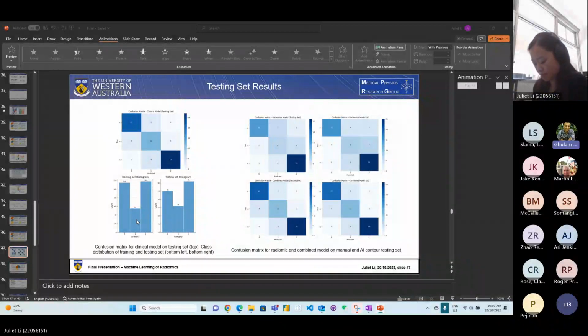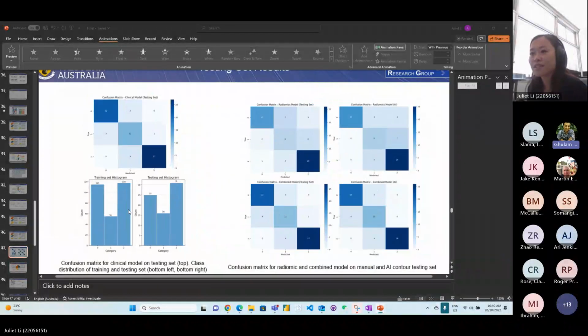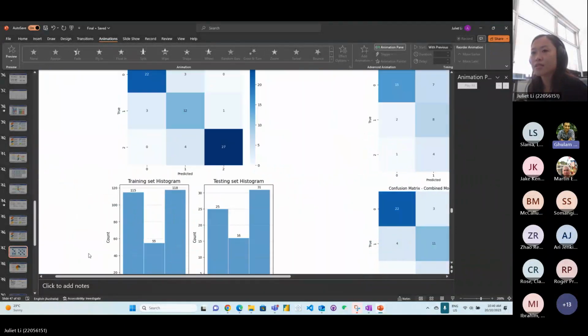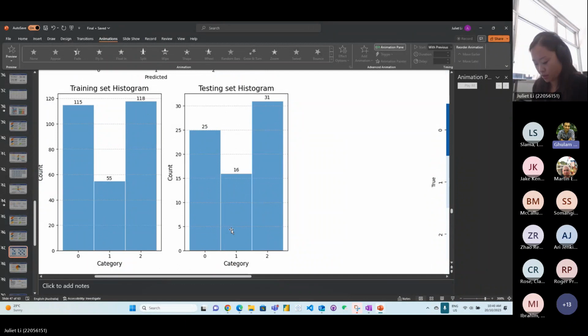Yeah, it is expected. And also one interesting thing, if you look into it, these numbers are too small for me to read. You can see how often you are misclassifying 0 and 2, because they are technically 2 apart and they should not be misclassified. This is one of the analyses you can look into using these confusion matrices. Yeah, that's a very good point. It's something that we can investigate because that would be a huge misclassification.